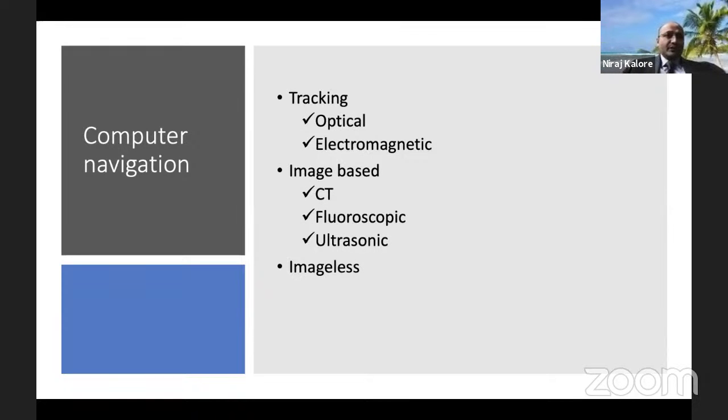Again, for every ultrasonic application, the expertise of the user becomes important. So there are variations and there are difficulties in applying that in keeping sterile probes and such. So again, it has not caught the mainstream attention so far.